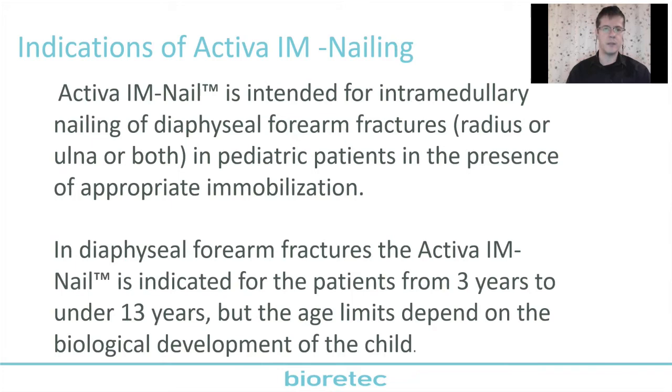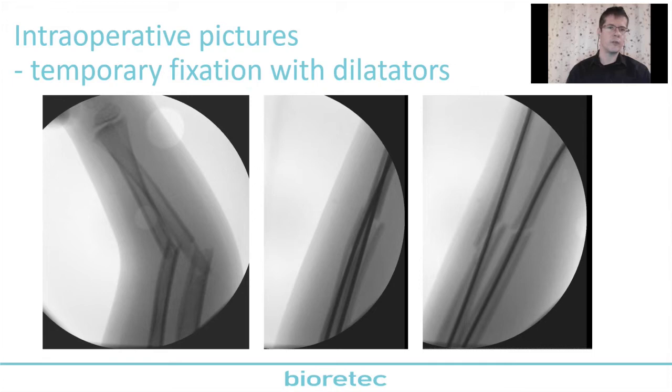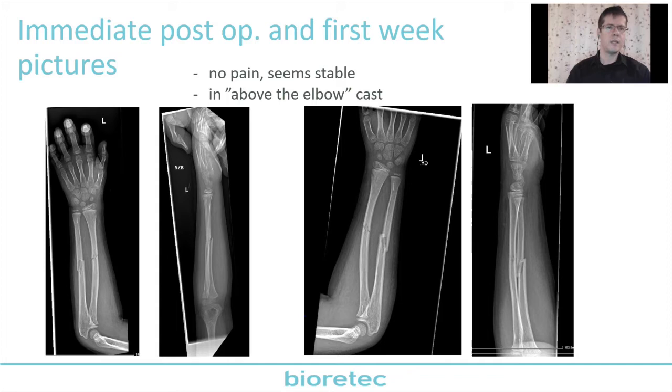Okay, and I would like to show a few cases of a few patients of ours. Here, this was our first patient, an 8-year-old boy who fell during some sport activity in school. Next slide, please. And we chose operation with IM nails. Here we can see the intraoperative pictures with the dilatators inside. Next slide, please. Here we can see the TCP labeling. These are intraoperative pictures. Next slide, please. And here we can see the result, the postoperative day and the first week. We gave him an above the elbow cast.